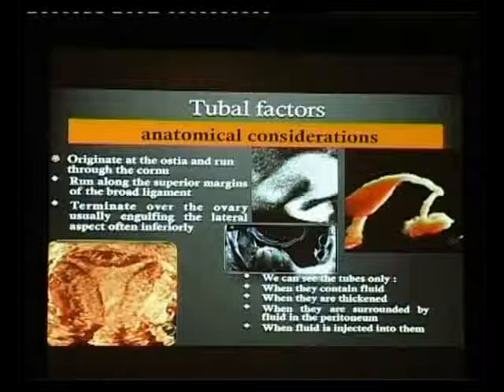And then there is the use of 3D technology to pick up hydrosalpinx and distinguish it from a cystic lesion that could be a large follicle or a residual cyst. So we can see that if there's some beaking, we can use these kinds of technologies to pick up any beaking or any suggestion of a tubular structure which may be different from a follicle.